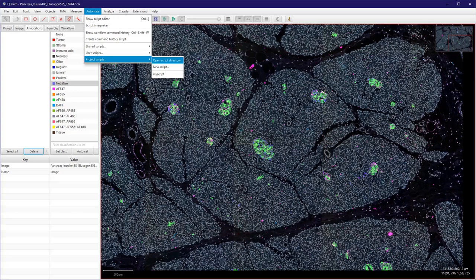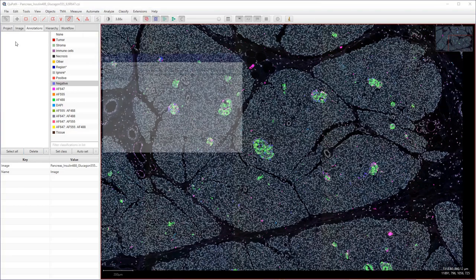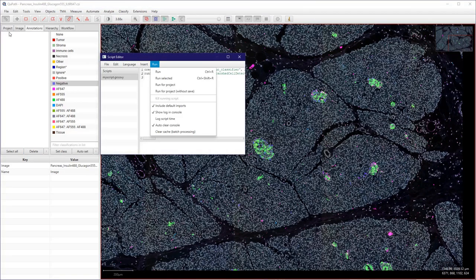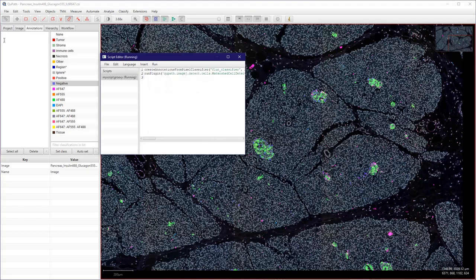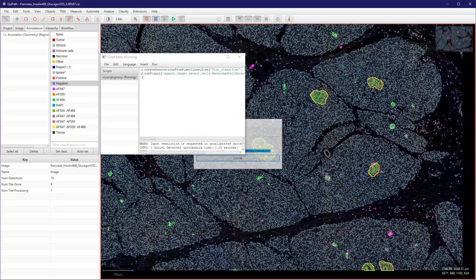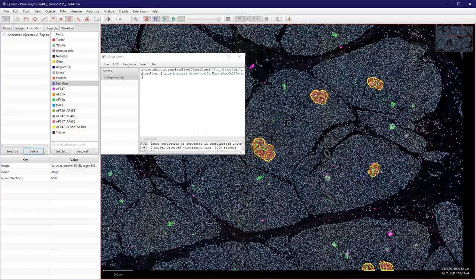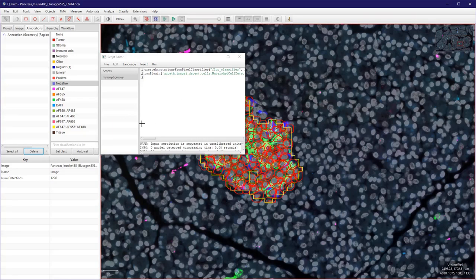So we can call it directly from here. It launches the script editor and you can just run it. And automatically you create your regions and do a cell detection.